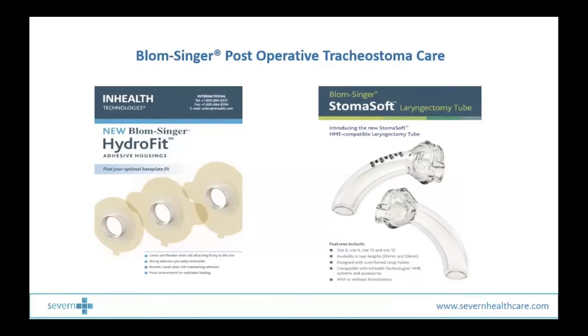These base plates can be applied directly over the surgical site and can help to aid healing, reduce infection, and also, most crucially, allow for the placement of a heat and moisture exchange cassette to enable the patient to commence pulmonary rehab promptly after surgery.